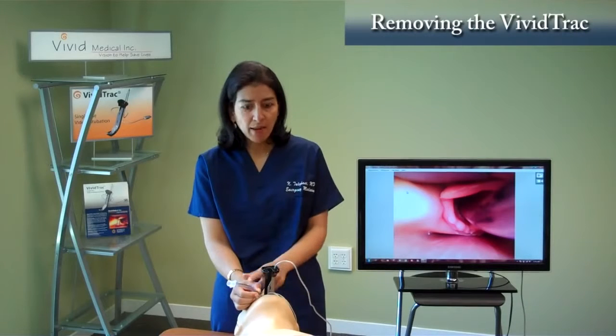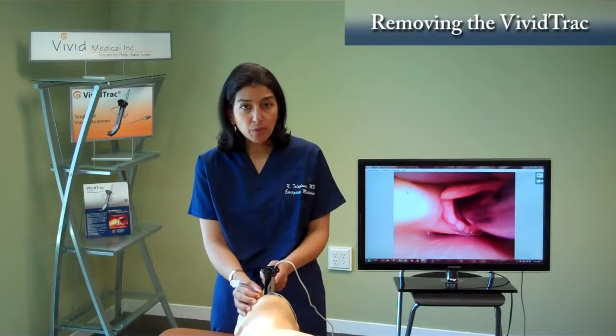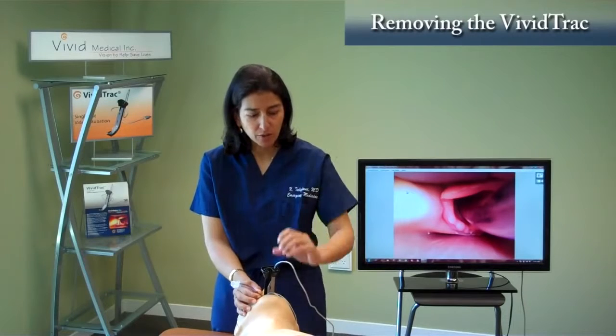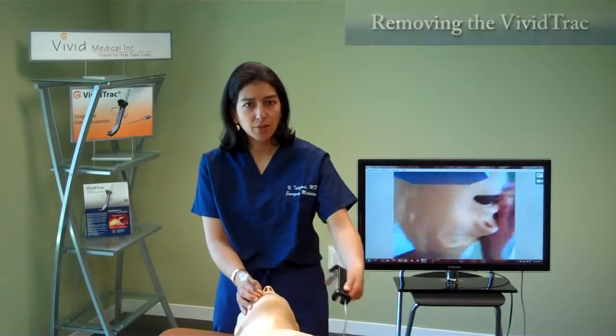You hold it to the side of the mouth, securing it as you would any ET tube, and then you want to remove the Vivid Trac device. The easiest and best way to remove this device is to simply reverse the process that you used to intubate. So you just hold it very gently and you slide it out of the mouth, and you're done.